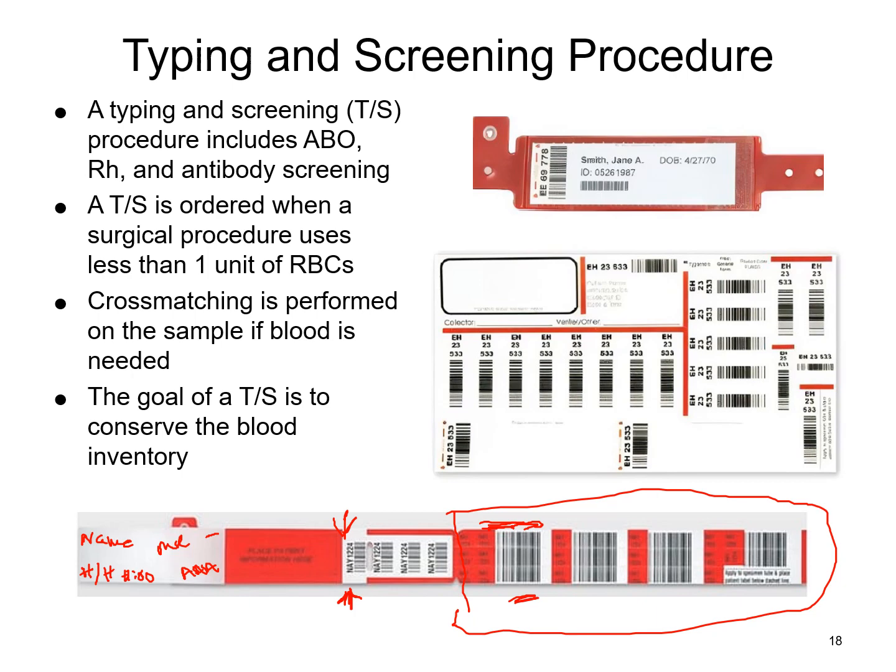You can sometimes have those blood bank bracelets or identifiers, or whatever you want to call them, in a sheet form where you would peel off the actual label wherever it's at. I think on here it's here.